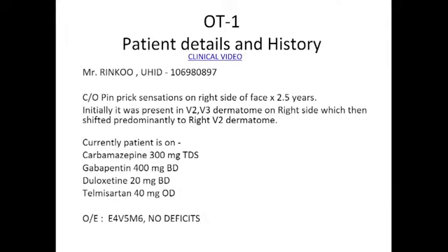Now do the stimulation. Keep increasing it, we will take it up to 0.3. Okay, now stimulation on. You have to switch something to on. Do you feel anything now? Is it the same? So he confirms that he is feeling the same amount of pain, in the same place.